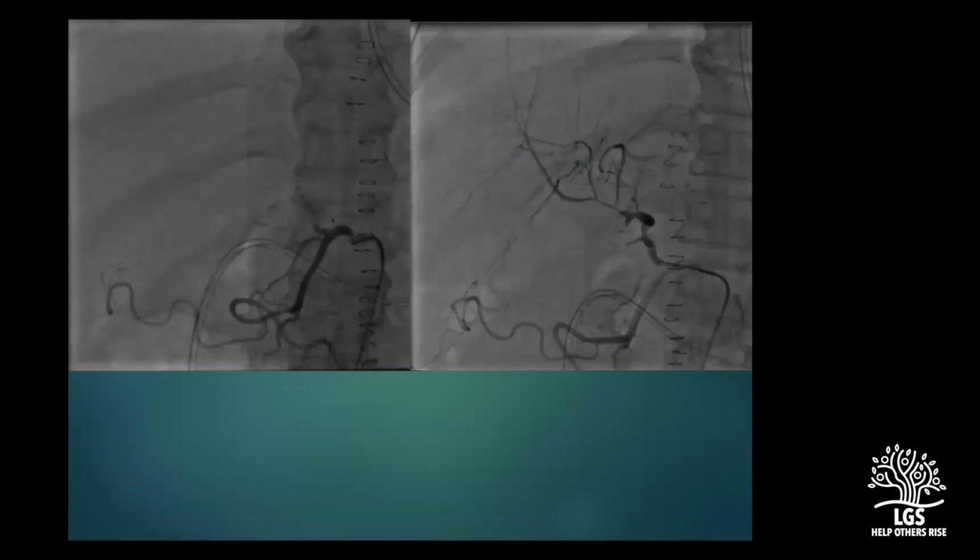Yes. This was a pediatric patient wherein we can get inside, and you can see on the initial angiogram on the left-hand side, nothing was seen. But later on, you can see that the branches started filling as we negotiated across the anastomosis. Angioplasty must not be performed if the anastomosis is fresh.